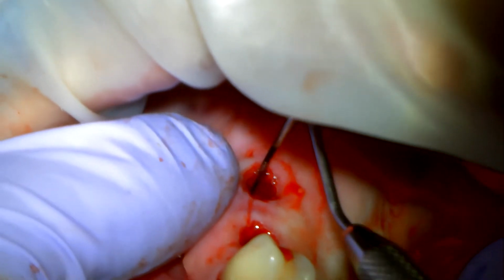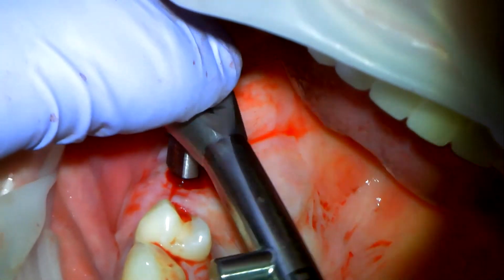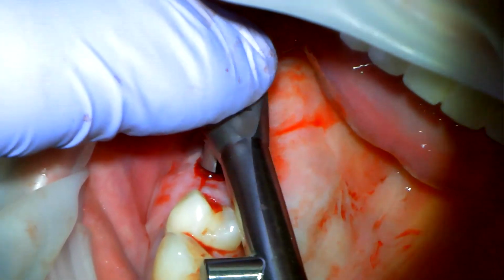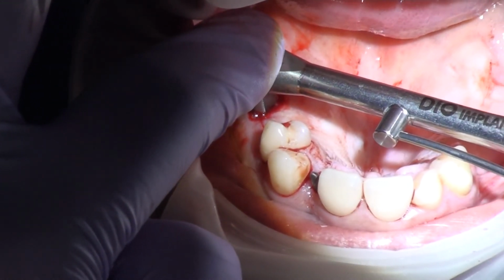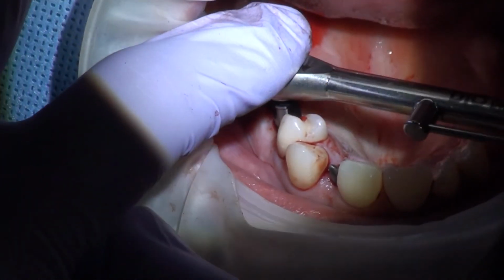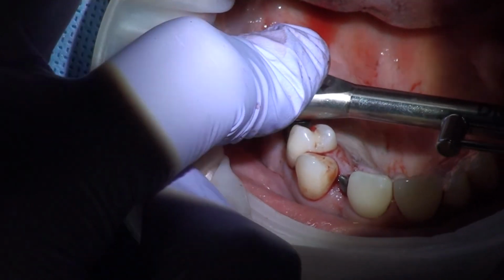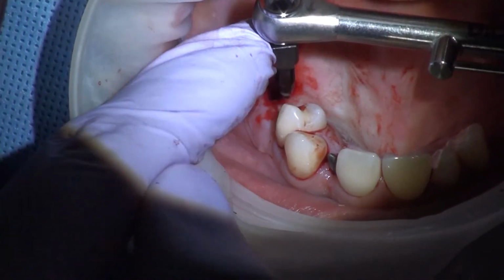I want to check just one more thing, see how much bone we have around the implant. That looks great. I'm going to check torque values one time. If my torque values are 30 or more, I'm going to go ahead and elect to put in a healing abutment. Otherwise, these will be a cover screw. So I'm going to let that drop into the hex. There it goes. I've got good torque on the back one. The front one. Good torque there. These will both be healing abutments.